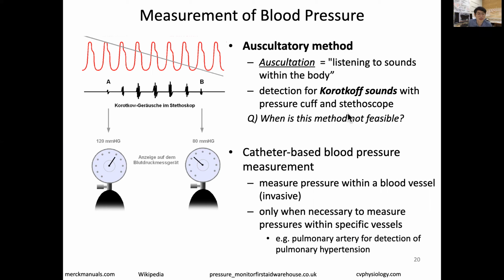This method is not feasible, for example, when a patient has an underlying lung problem and you need to check CO2 and oxygen of blood frequently.